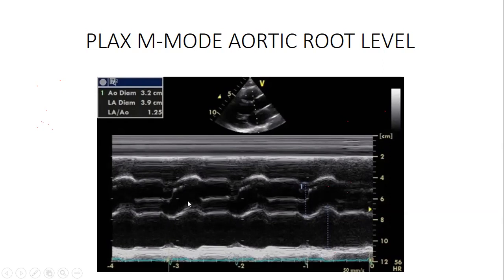Sometimes you find a very nice box. It forms a very nice box. I'll explain where that box comes from. For now, this is a depiction of the M mode on the long parasternal axis. Are we clear? Yes, we are.